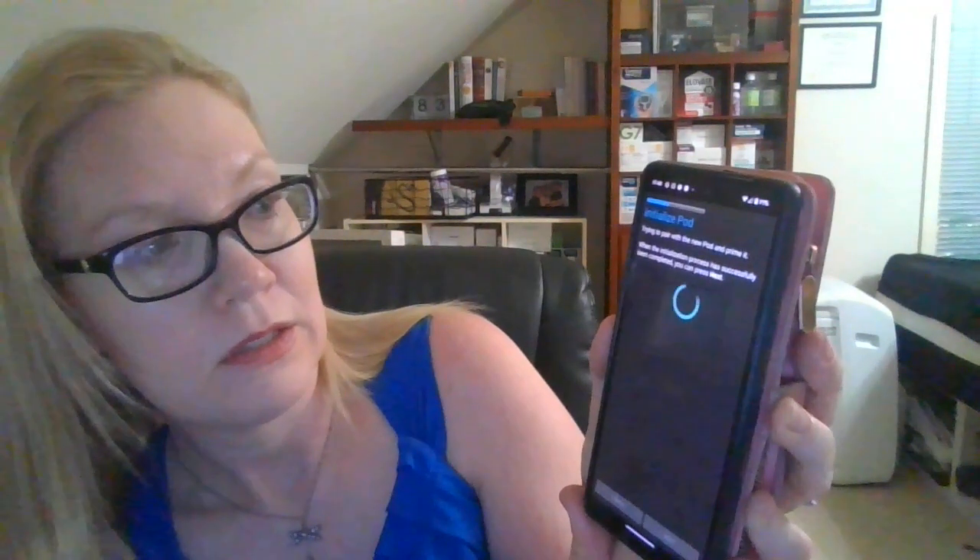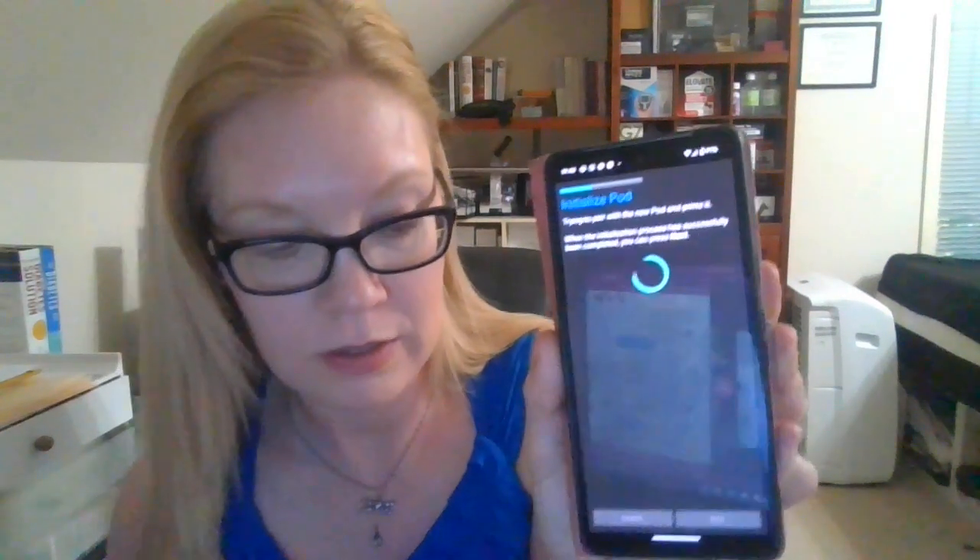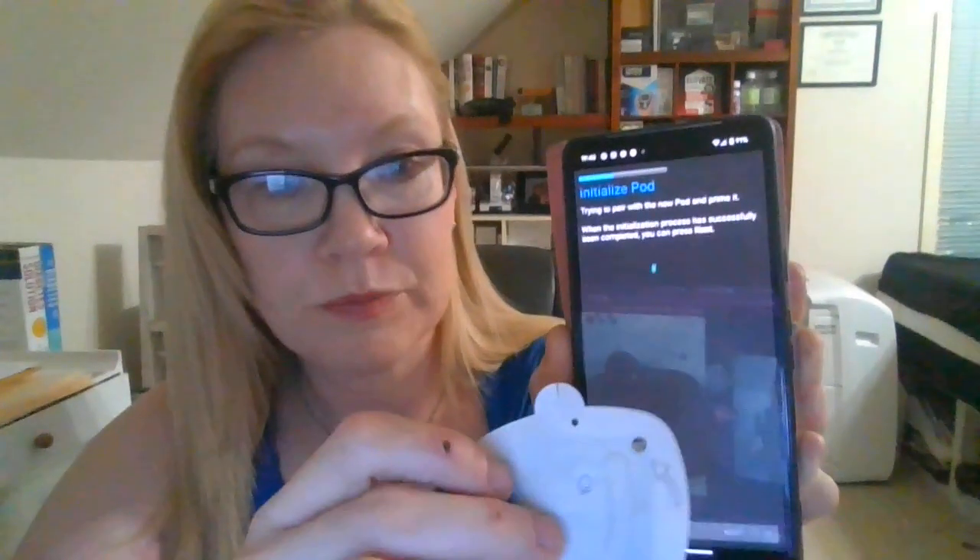Now that the pod is full, I'm clicking Next. And now it's initializing the pod. Now it's making the little clicking sound you hear.